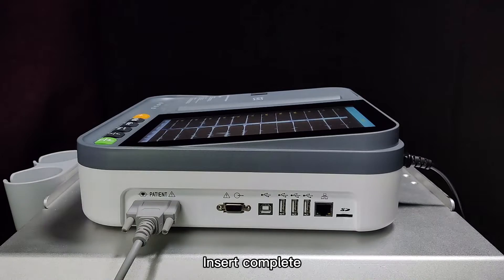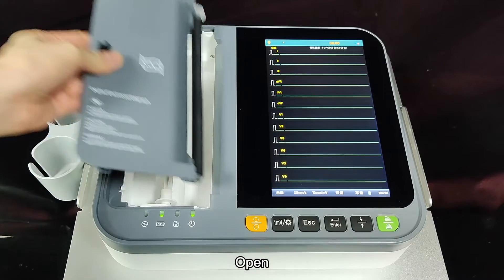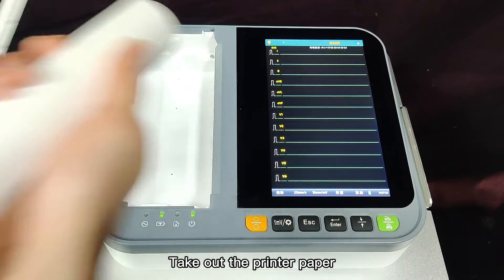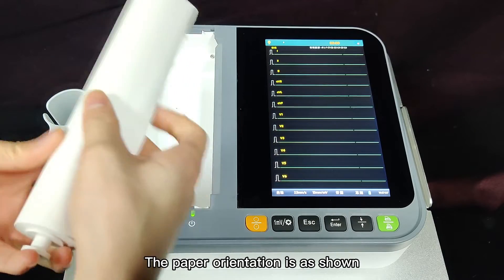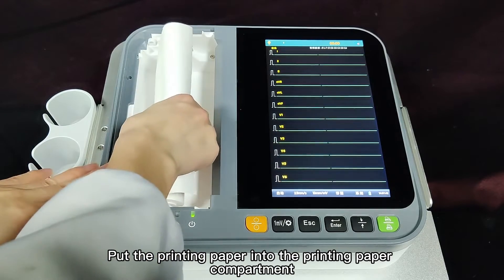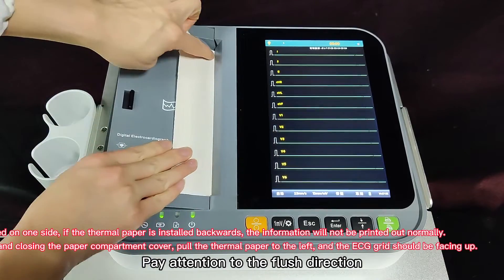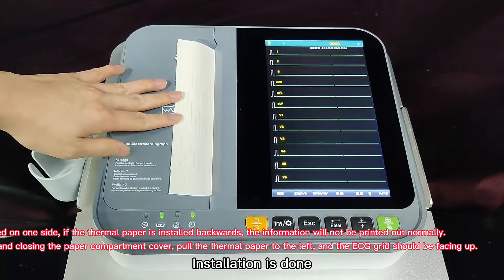Insert complete. To open the paper compartment, press and hold and swipe to the left. Take out the printer paper. Thread the printing paper into the printing paper shaft, then take out the paper. The paper orientation is as shown. Put the printing paper into the printing paper compartment and close it. Pay attention to the flush direction. Installation is done.